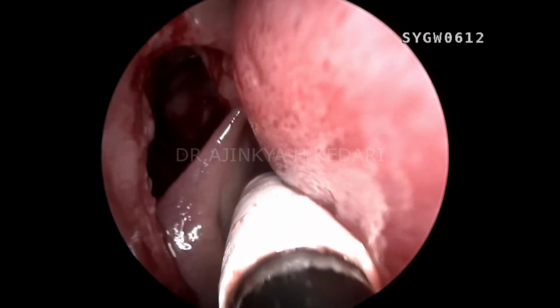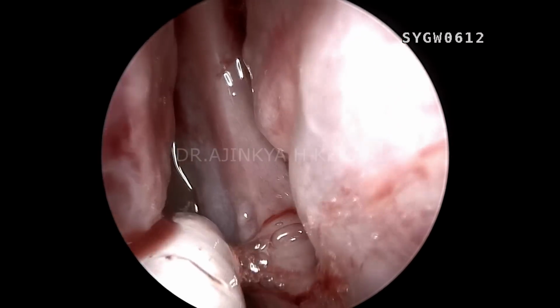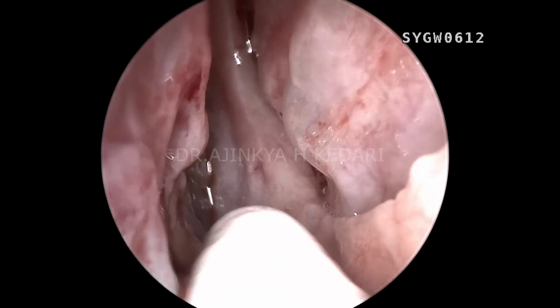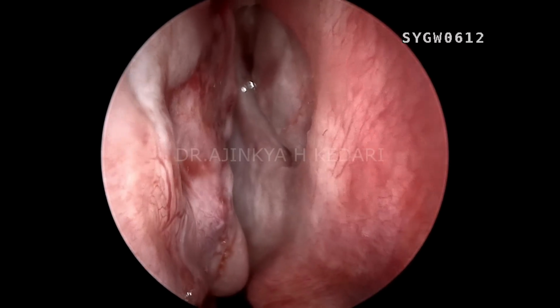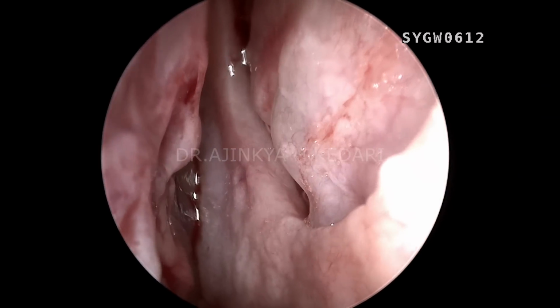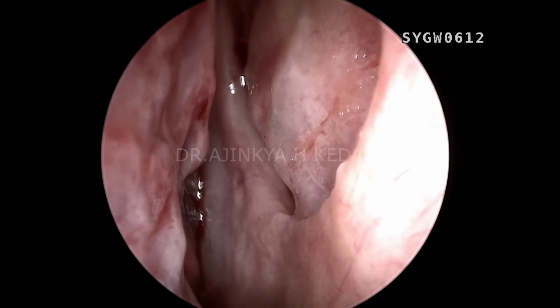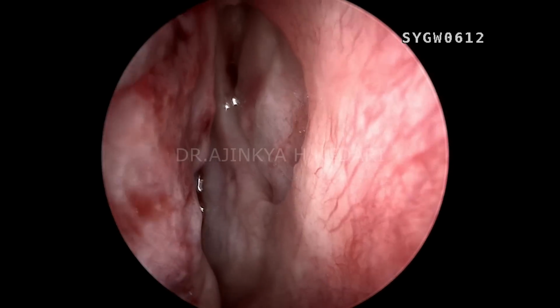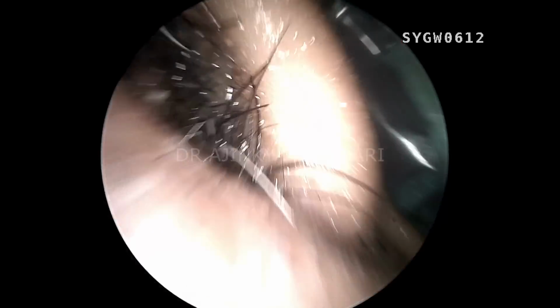But when this patient's history was taken, the patient denied having had an endonasal approach done by any other surgeon, and there was no history of this patient undergoing an endonasal procedure. But you can see there's a very well devised superior posterior septectomy, and you can see the middle turbinate from the patient's left side as well.